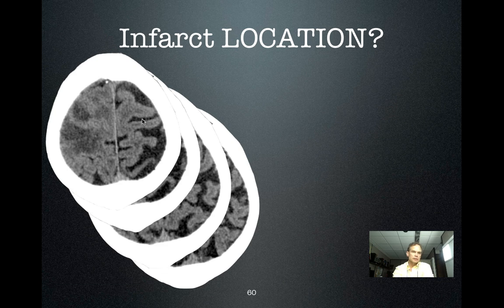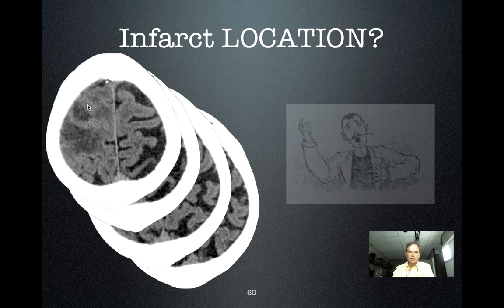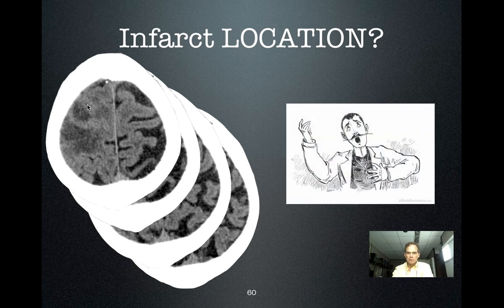Here we have the central sulcus because we have the cingulate sulcus — cingulate sulcus forward and to the side — central sulcus. You've got the infarct encroaching a little bit on the frontal lobe, specifically the precentral gyrus or motor cortex, but not much.